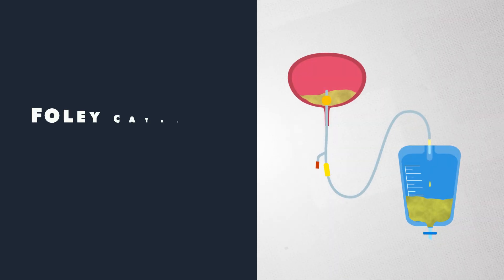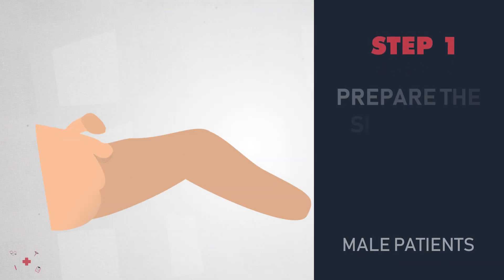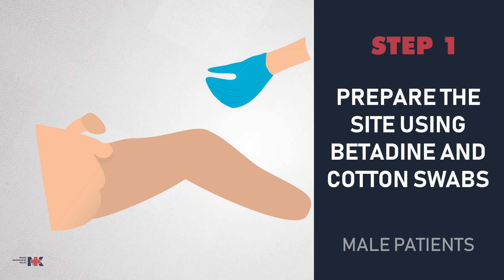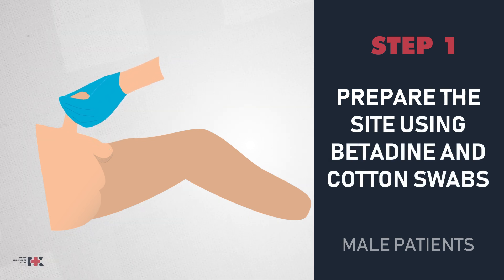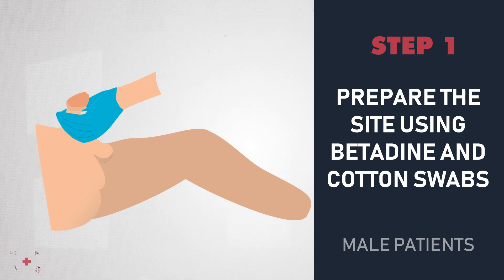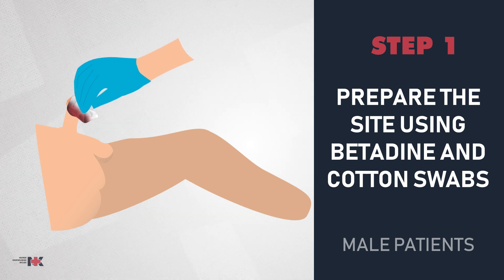Now that we have all of our things, we're going to start the insertion process. For male patients, prepare the site using betadine and cotton swabs. Hold the penis at a 90 degree angle. If the male patient is uncircumcised, be sure to pull back the foreskin. In a circular motion, use the first swab from the urinary meatus all the way down to the base of the shaft.